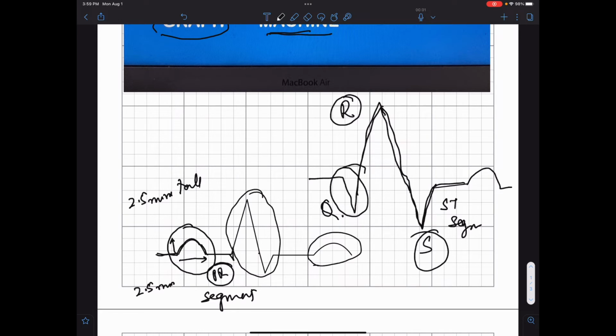So these are a few of the things which occur in almost all the leads, and we must always start with the identification of the first wave, the P wave, and then subsequently follow the wave patterns which come, because it is from this systematic approach that we will be making the diagnosis of different conditions.